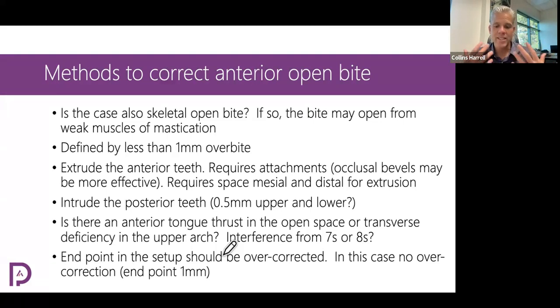With aligners, because the movements are happening inside of this plastic, the teeth are kind of protected by the overall appliance from the forces of the tongue. So as the patient tongue thrusts, they're not able to put pressure on individual teeth and continue to push those up. Everything that's happening, if they tongue thrust, the whole aligner is feeling it and it's not going onto those individual teeth. And they actually tend to just function differently when they have those aligners in place. So, be aware of a tongue thrust. Often we'll want to refer the patient to a myofunctional therapist.